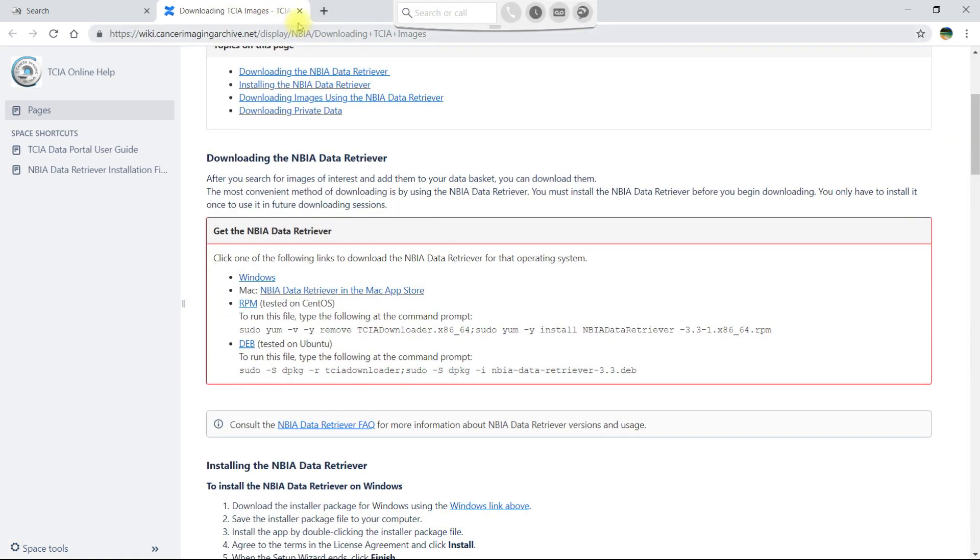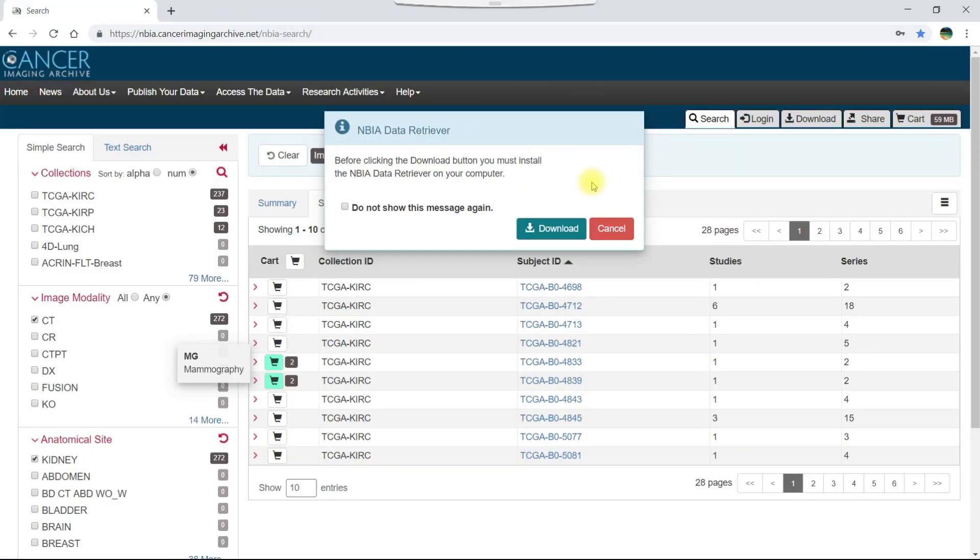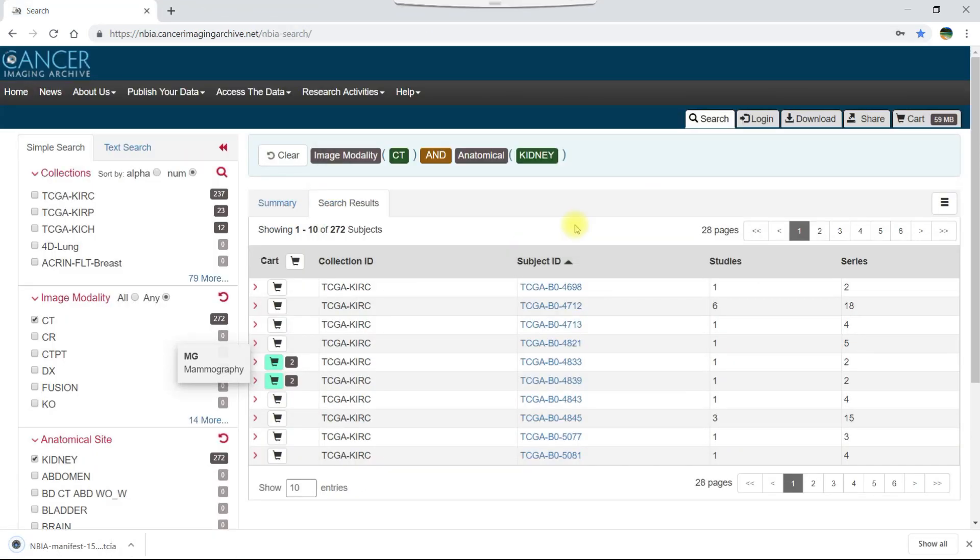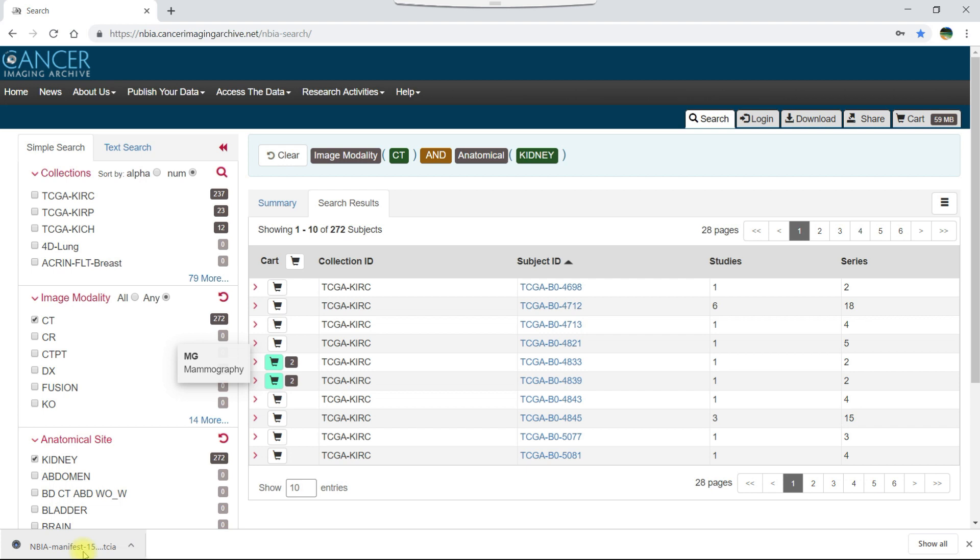Once you have installed the data retriever, click the download button. A manifest file opens in your browser. A manifest file contains all of the information that the data retriever needs to download the images you selected. Notice that its file extension is .TCIA and that only the data retriever can open this type of file.